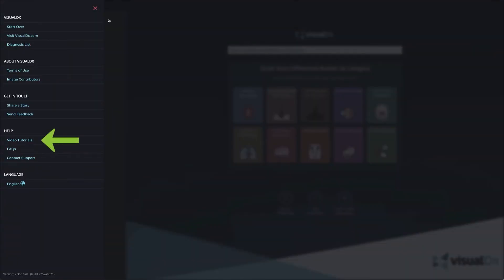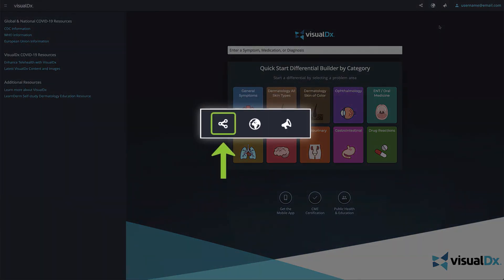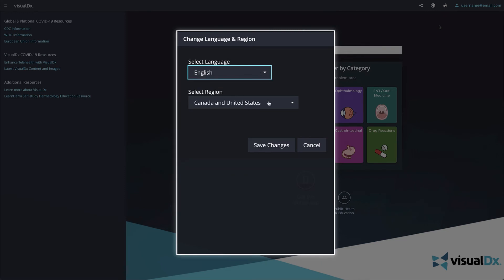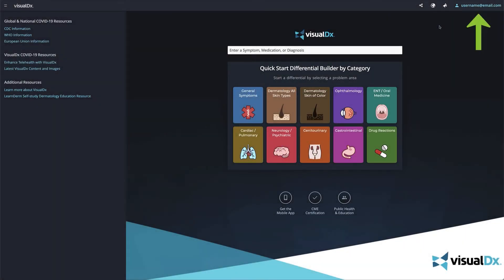We have compiled common public health and education links so they are easily accessible from the home page. On the left side, we've linked important information for users. If you access VisualDX through your workplace, you may see customized links in this location. Click into the left menu and you can access support, tutorials, and send feedback — we use your feedback to continually make VisualDX better. On the top right, the share icon is on every page and will copy the link to share your differential or a diagnosis with a colleague. The world icon lets you change your language and region, and the megaphone icon lets you send us feedback.